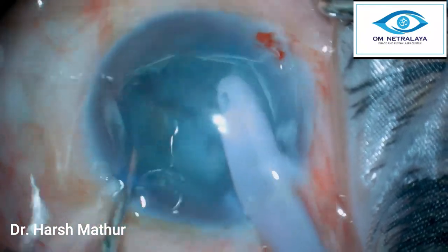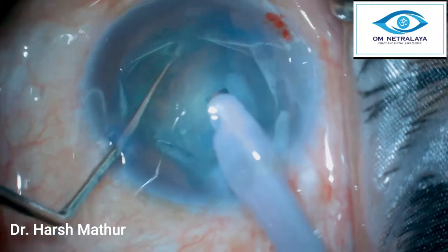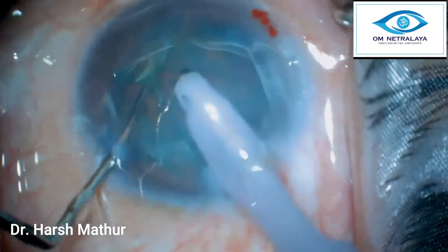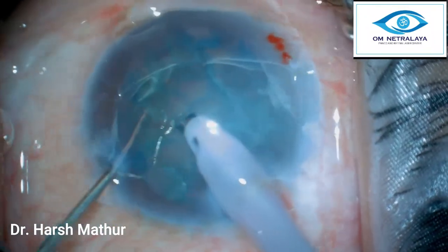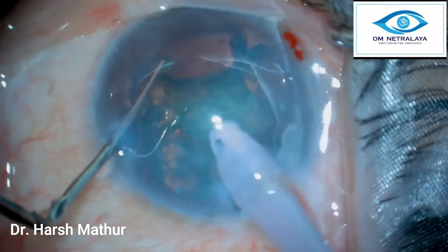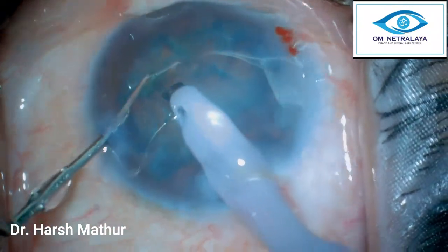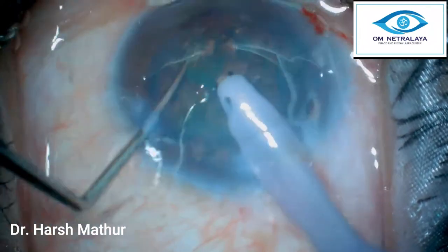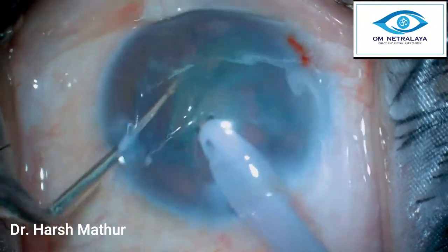Even as I try to hold this soft nucleus, the phaco probe is eating it away. It is such a soft nucleus that holding it is a big problem; I am trying to bring out one hemi-nucleus. In such soft nuclei where the probe is unable to get a good hold, this pre-chopper gave a very quick and easy division. In this soft nucleus, even getting two hemi-nuclei is enough — we can bring out one hemi-nucleus at a time and, using minimum vacuum, emulsify the complete nuclei.